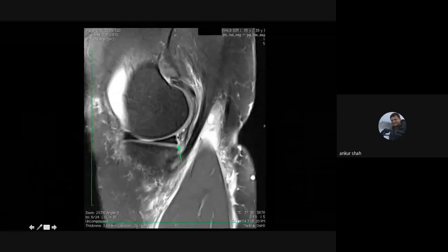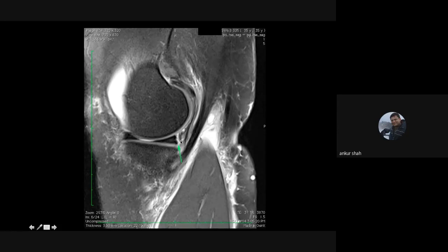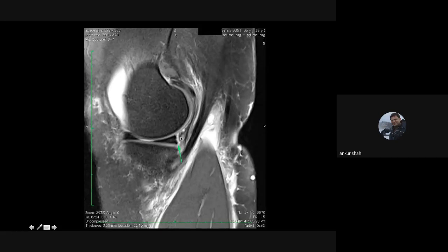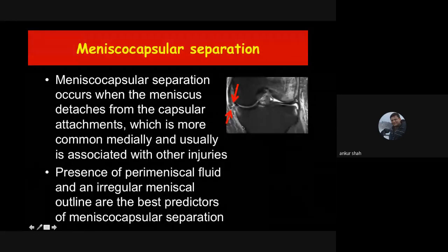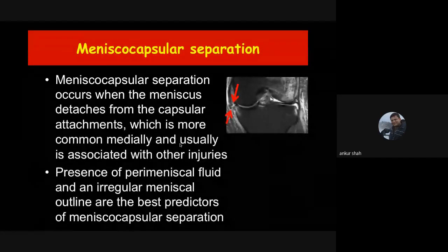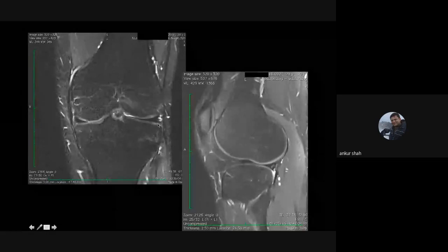A focal hyperintensity vertical in orientation looking like a longitudinal tear but with no meniscal tissue left posteriorly may actually be a meniscocapsular separation. This occurs in cases of the medial meniscus, which is firmly attached to the joint capsule. When there is separation of the meniscus from the joint capsule — meniscocapsular separation — fluid appears between the medial meniscus and the joint capsule. This would not occur in the lateral meniscus since it is already loosely attached.